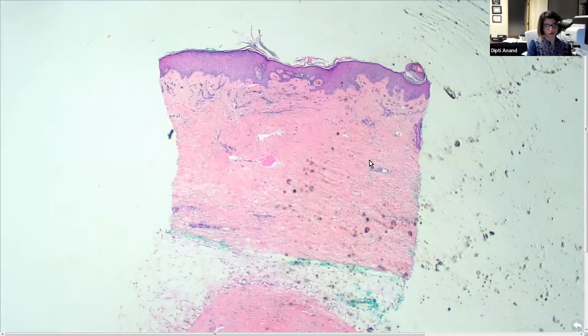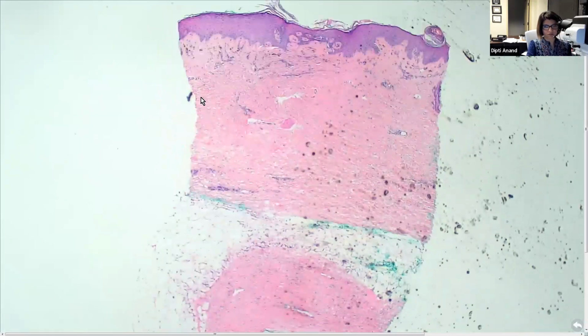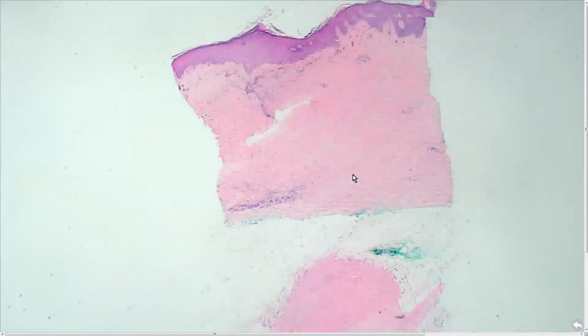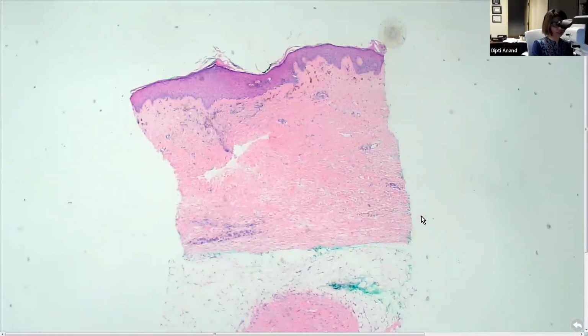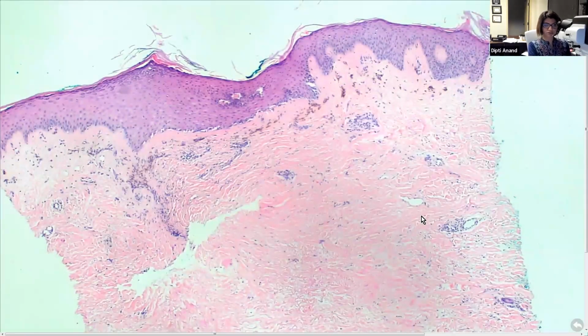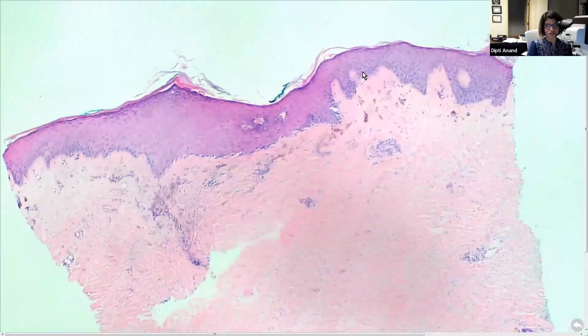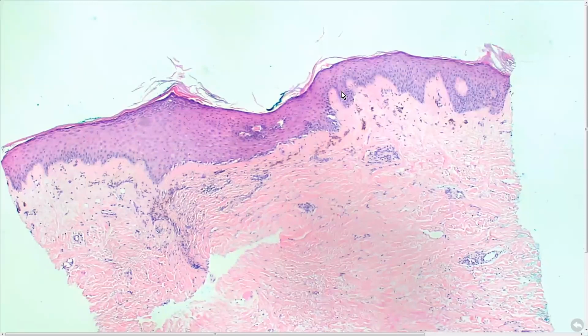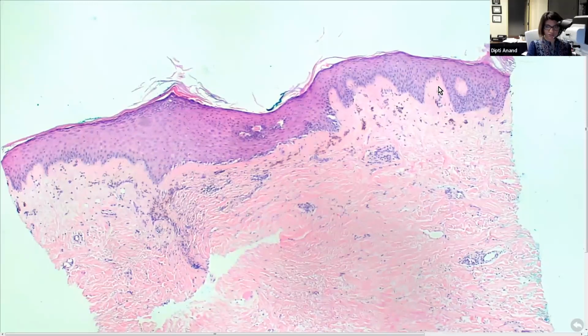is your scleroderma. So we were talking about the epidermal change, right? You can see that everybody agrees that this is scleroderma, morphea. Very square, very thick dermis. You can see the loss of the space between the collagen bundles, right? I see some little inflammation too. Yes, you do have the inflammation, but in this particular instance, the overlying epidermis is actually affected. You see that? Because it's thickened. It's thickened, exactly. And it has all these holes and spaces. So guys, you can completely forget about it.